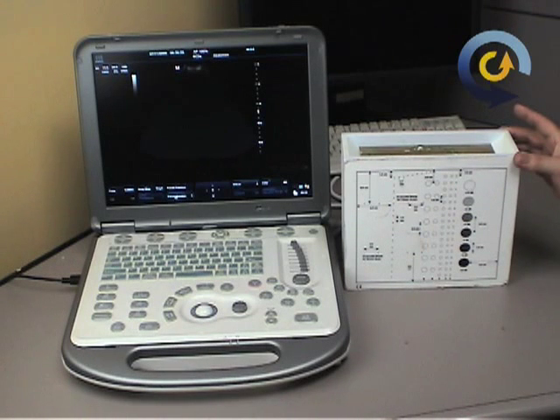The real advantage of that is it gives you something that's consistent and stable, that you're looking at the same thing each time. When you make photographs of a phantom image on a particular ultrasound machine with a particular transducer, you can then use that as a reference photo to go back over time and find out if the image has changed, if the photography has changed, or in fact if there are problems with the system that were not there previously. And that's one of the main features, is actually to document it.